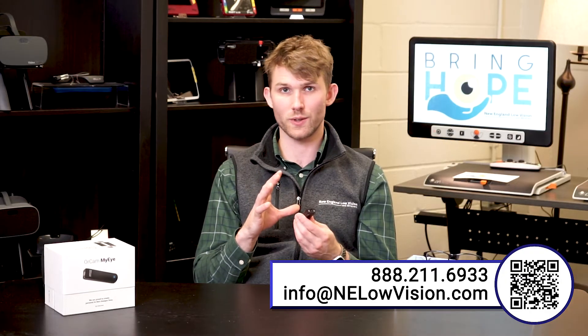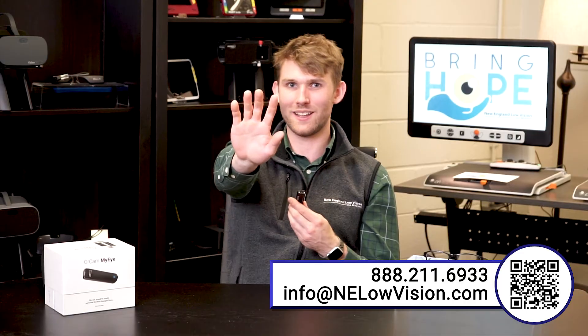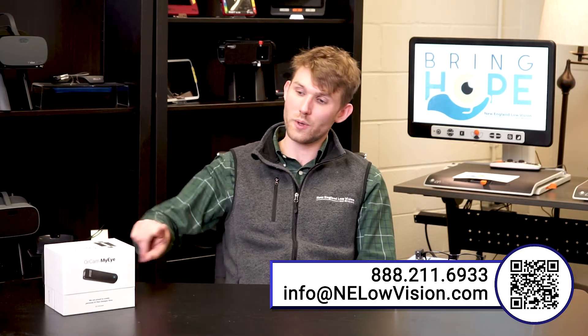There are also a couple of gestures for this device. A pointing gesture lets you point to text, and whatever is under your finger it will take a picture of and read. There's also a stop gesture — when you're using a function and want to stop, you just put your hand out and it will sense your hand and stop. So if we see any text in our peripheral or central vision, we can point to it and the OrCam MyEye will take a snapshot and read around where our finger is.